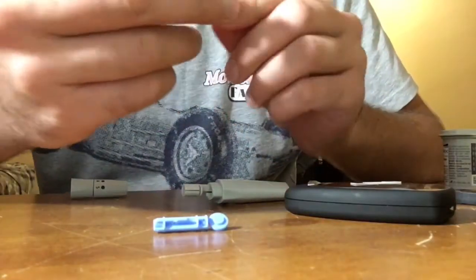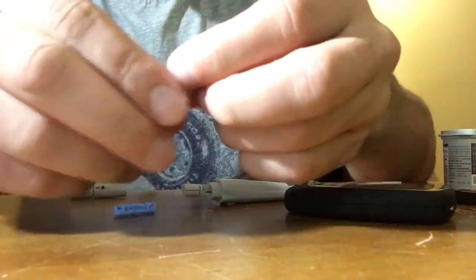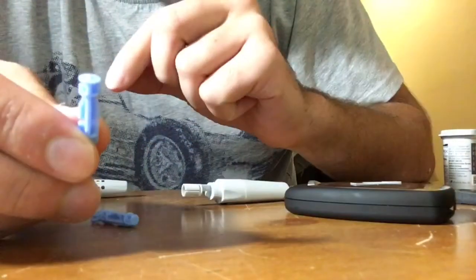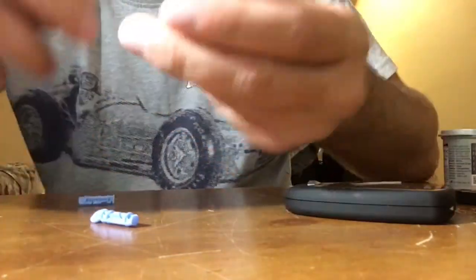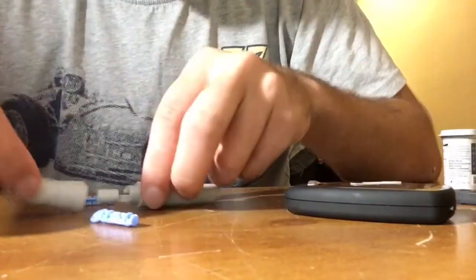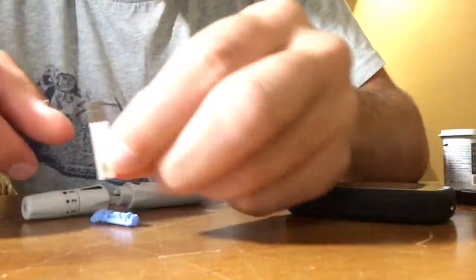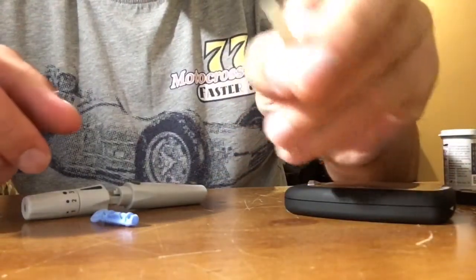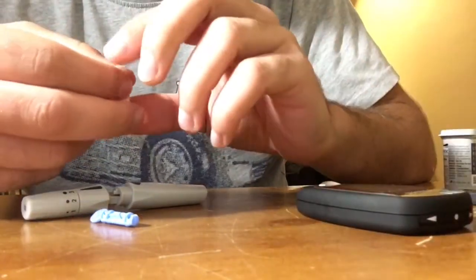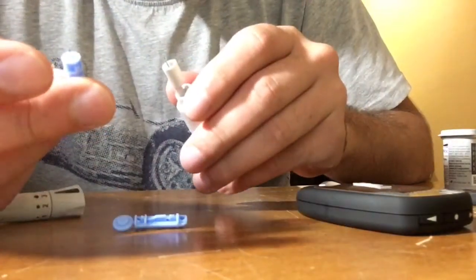In order to start this process, we need a needle — it comes with a cap on it, we'll just remove this cap. And then we have a lancing device with a cap on it, and a test strip which looks like this, and the meter itself.